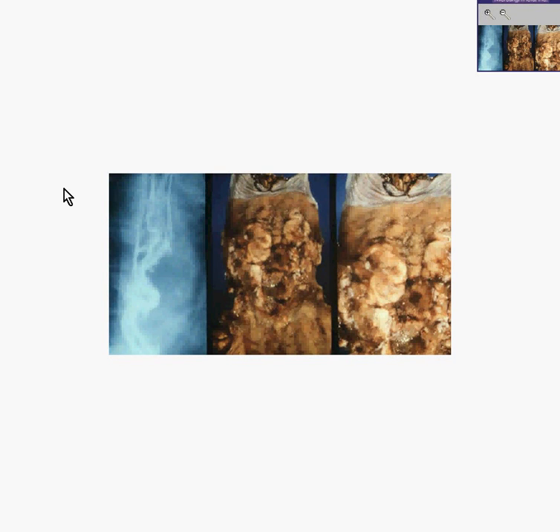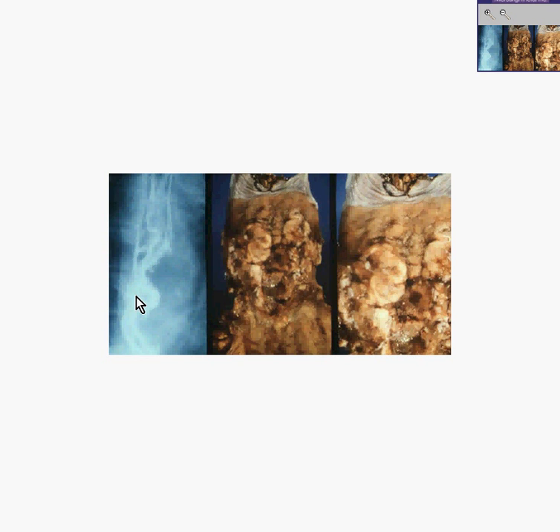Here is another GI organ — in this case, it happens to be the esophagus. Here is what they call a barium swallow, in which the patient swallows barium, which is radio-dense. Although you can see normal streaking along the mucosa in the upper portion of the esophagus, you can see an area in which you have bulging and retention of the barium.